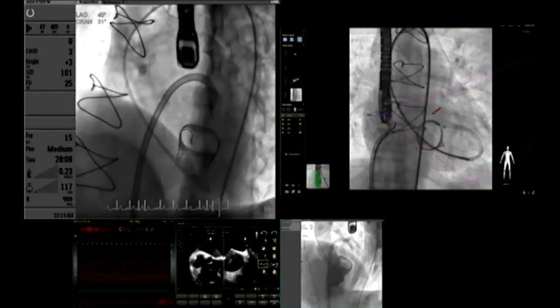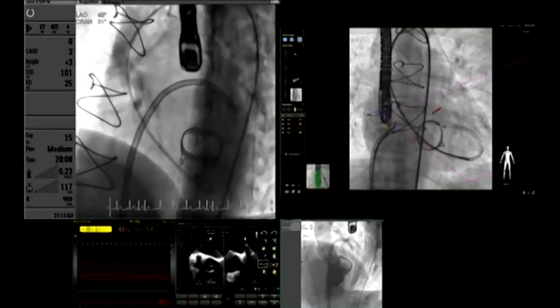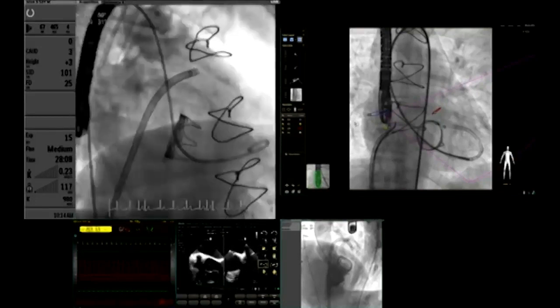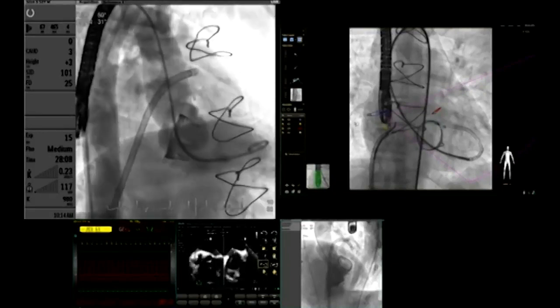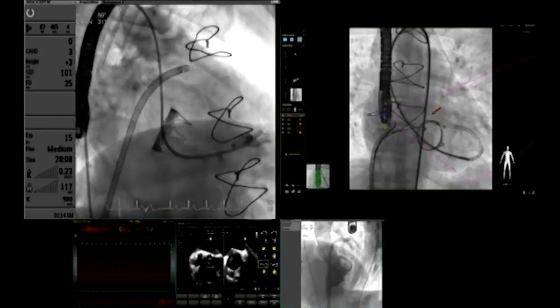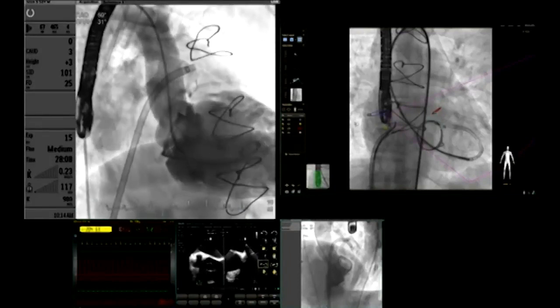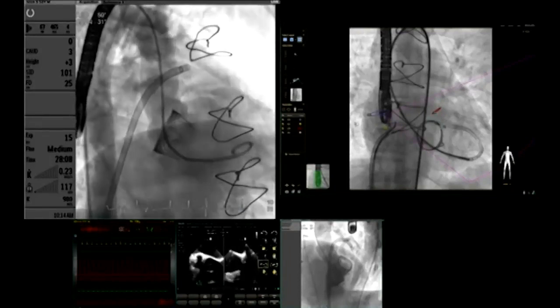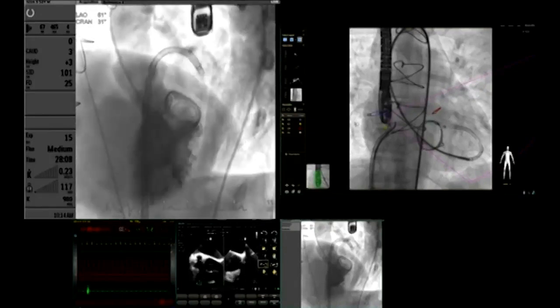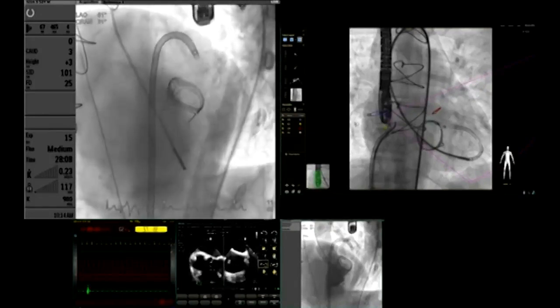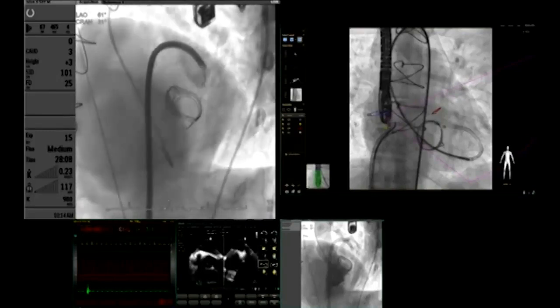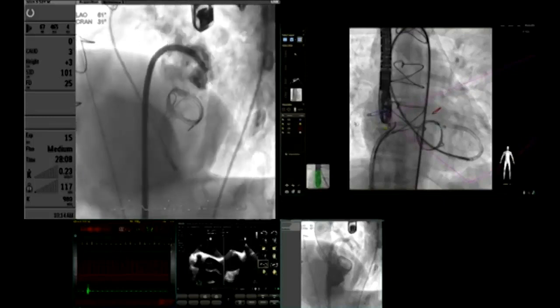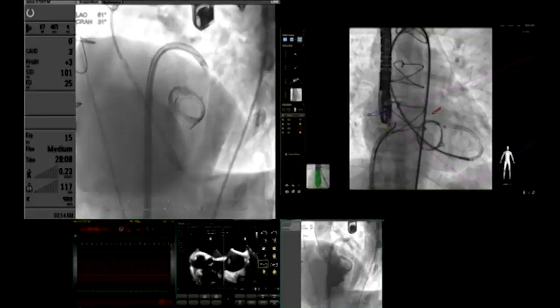This is the Agilis 8.5 French sheath, which is commonly used by the EP guys. Then the next step was the left ventricular angiogram. Because it is steerable, you can appreciate the paravalvular leak here. We then went into the projection where the paravalvular leak comes out of the mitral prosthesis. The Agilis sheath was pointing towards the left atrial appendage because the appendage mouth and the paravalvular leak are pretty close to each other.